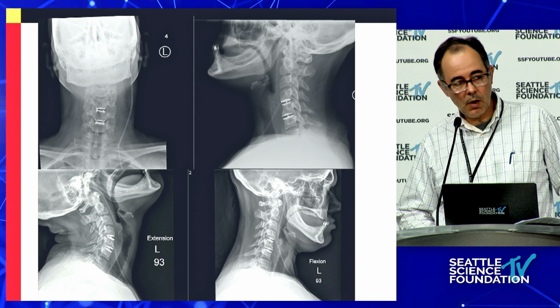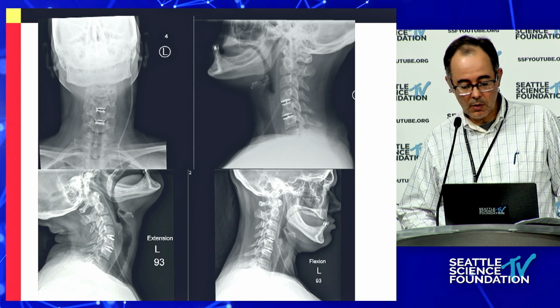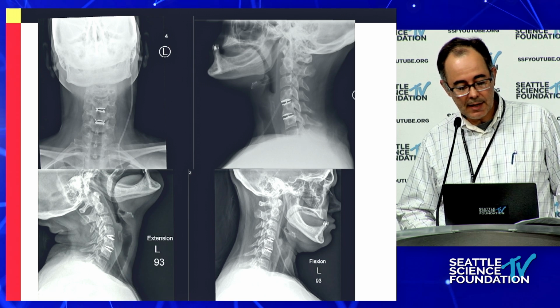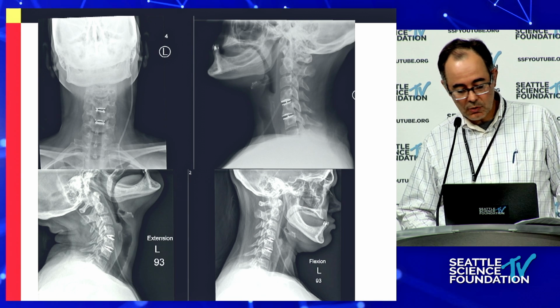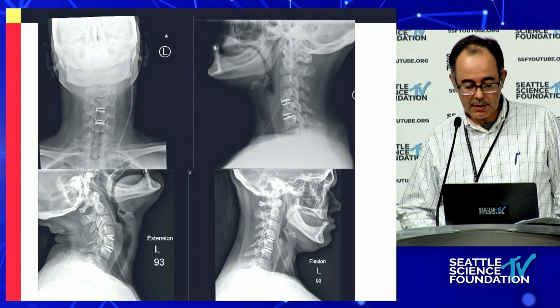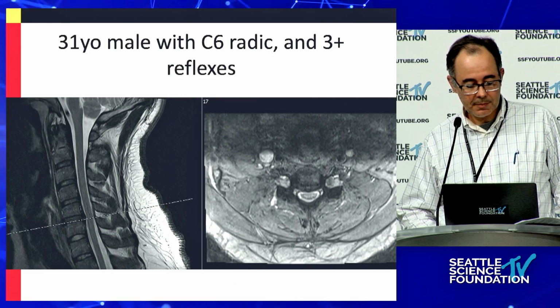The insurance often won't cover a third level. That's her. Despite the fact that the 5/6 disc space was more ankylosed, I was still able to reintroduce motion there, and she had some resolution of symptoms.